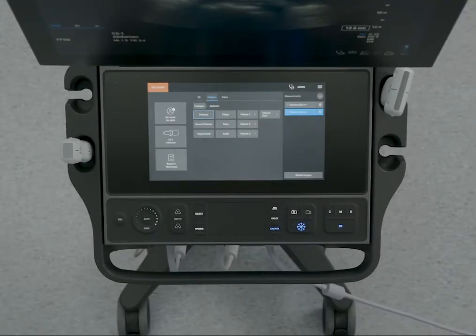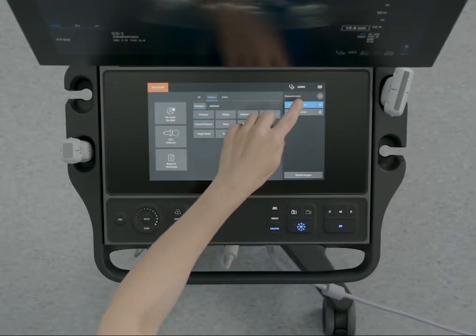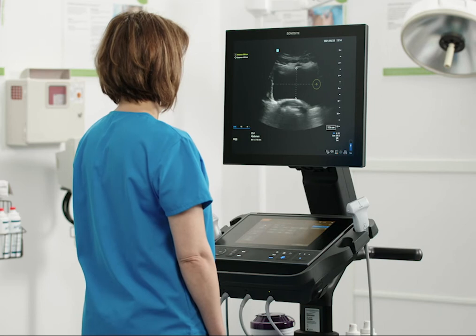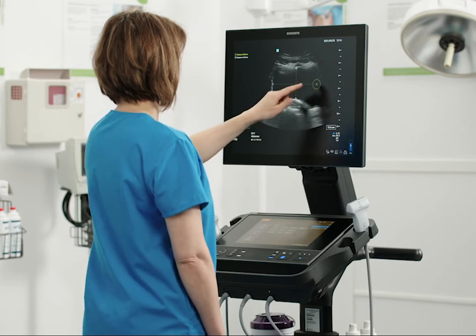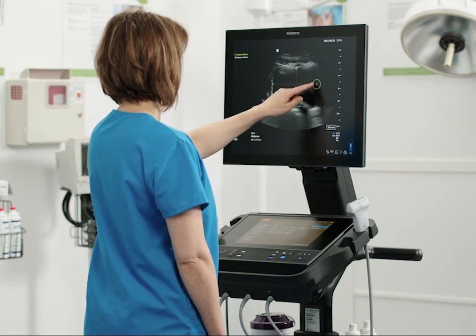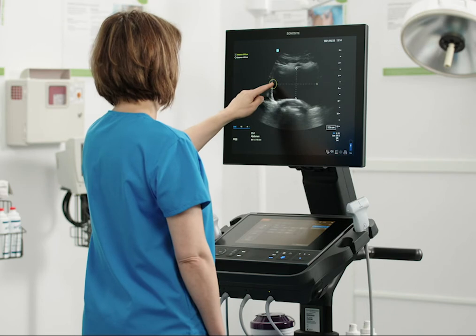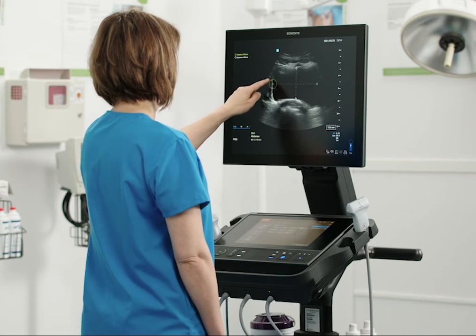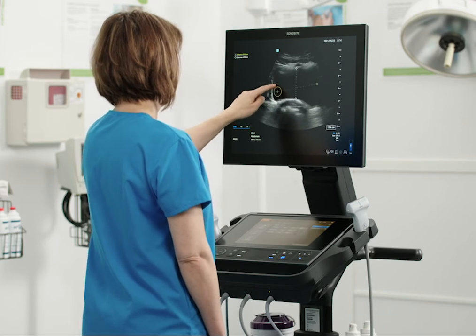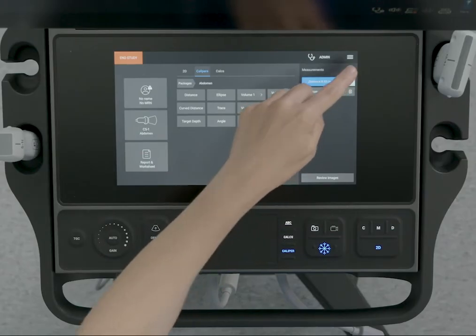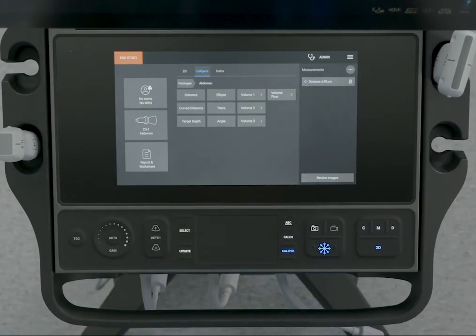To change a measurement, tap the measurement in the results section of the touch panel. Press select until the caliper you want is highlighted, and use the touchpad to move it. You can also tap and move it on the monitor touch screen. You can also delete the measurement if you wish.